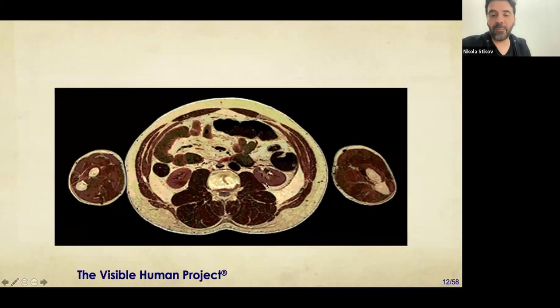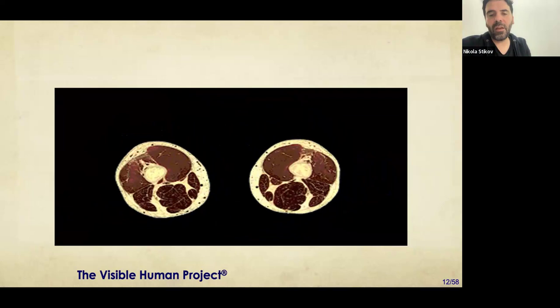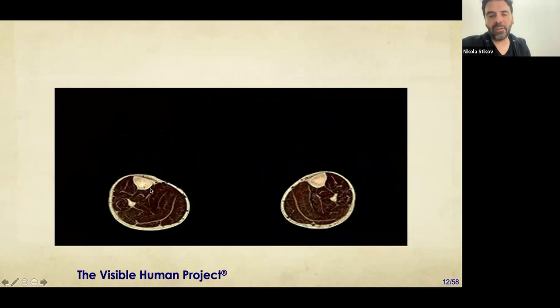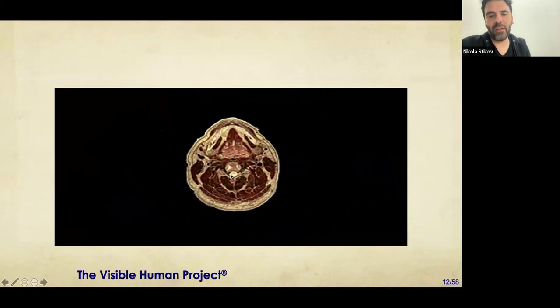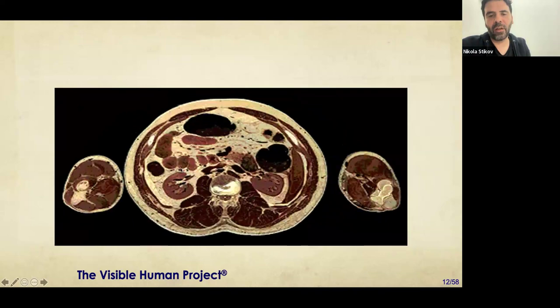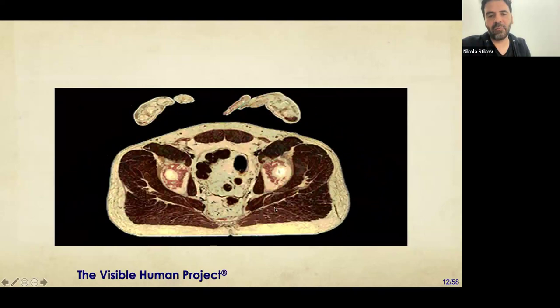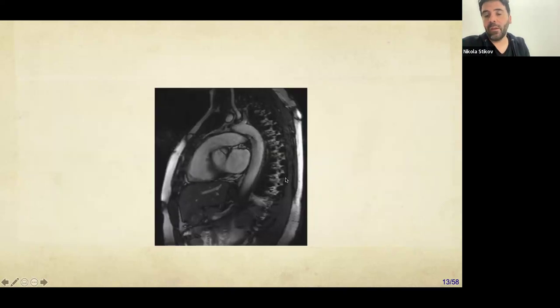That is a combination of computer tomography, CT, MRI, and histology. And now we're going through the legs, and now these are going to be the feet. And then we're going straight from the head, neck, shoulders, lungs here, liver, intestines, pelvis, and now we're going on to the legs. It's also possible to image moving body parts, and in particular, this is an MRI of a beating heart.